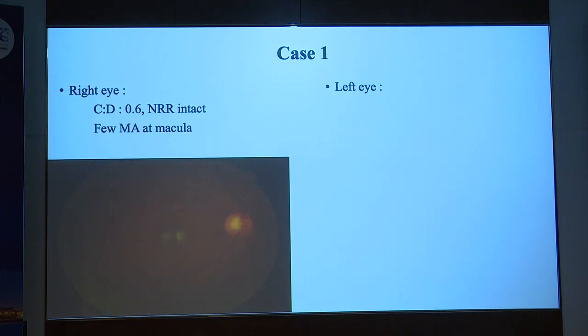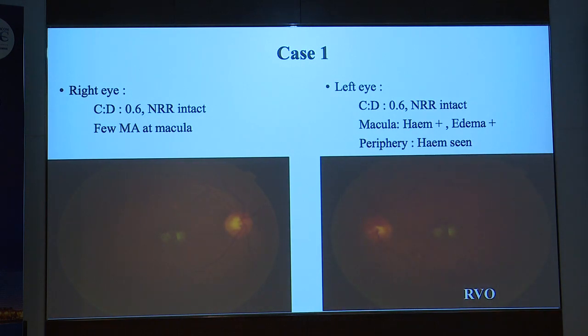Now coming to case number 1. He's a pulmonologist from our town who had a BRVO. He was with us for a long follow-up, even before I got the ultra-wide field.